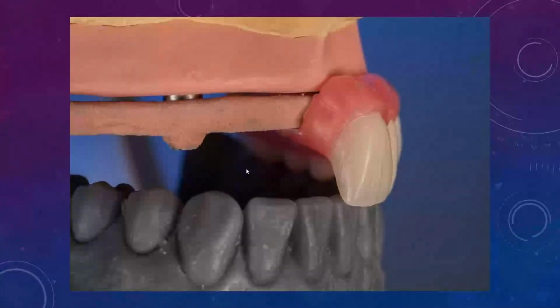Okay, and from here I'll do the setup on top of the bar. Now some people would say, oh, why are you doing it right there? Because wax will get trapped in there and you'll have some bonding issues. If you do your boil out technique down the line properly, it's not an issue. What I basically will do is I'll do a boil out regularly, and then I'll take the bar off and steam clean it very well to make sure all the wax is gone, and then I'll use the VITA bond on it before processing, guys.